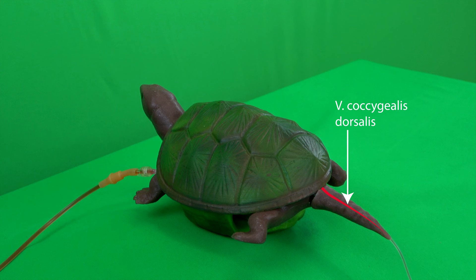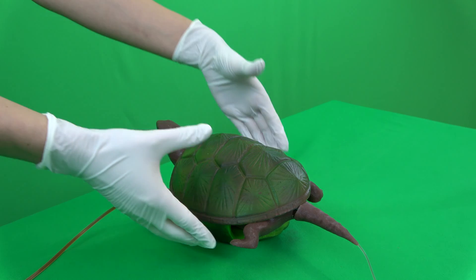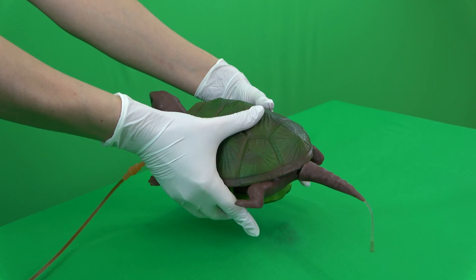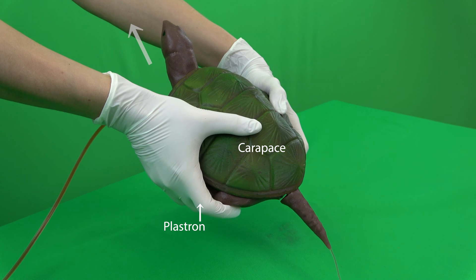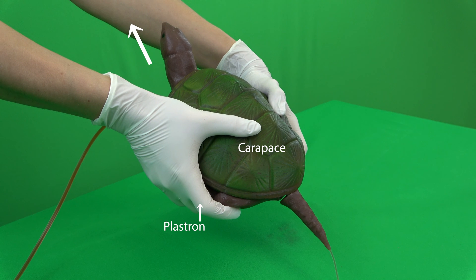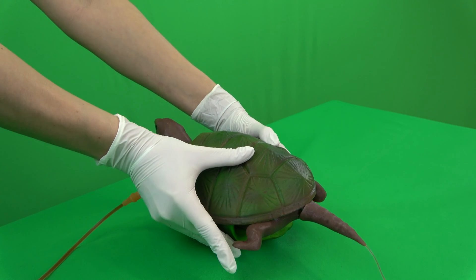Alternative sites in turtles are the subcarapaxialis plexus, and under sedation also the jugular vein. The live turtle must be restrained by an assistant, held with both hands with the thumbs on the carapace and the remaining fingers on the plastron, so that the animal's head points towards the assistant and dorsally. The turtle's front limbs should not touch the ground, and you should make sure to hold the turtle's head so that it cannot bite. Here on the model there is no need for fixation by an assistant.